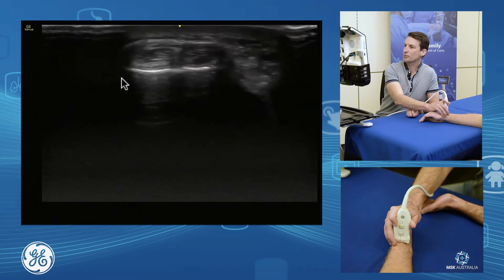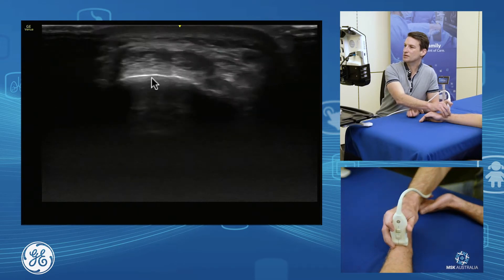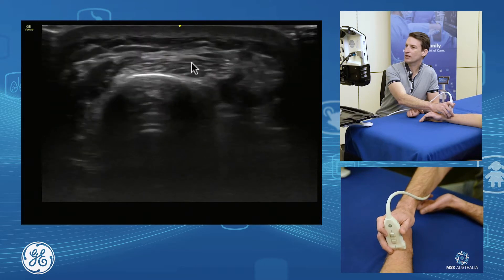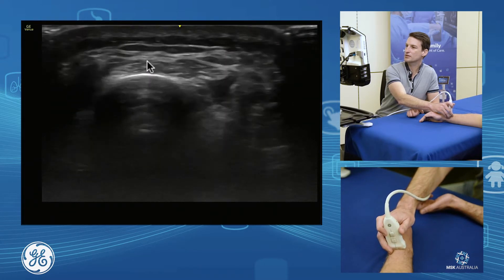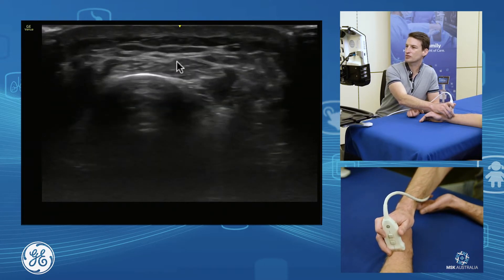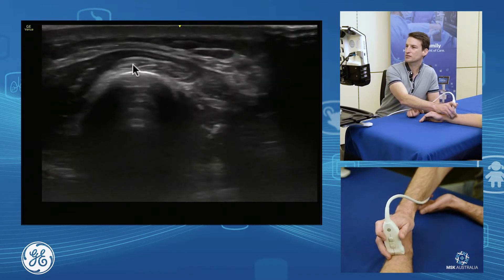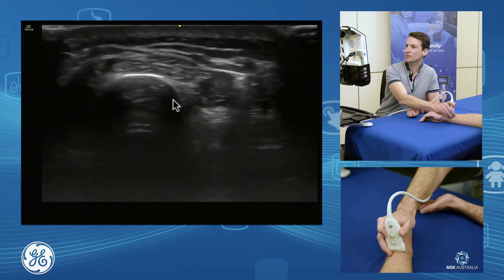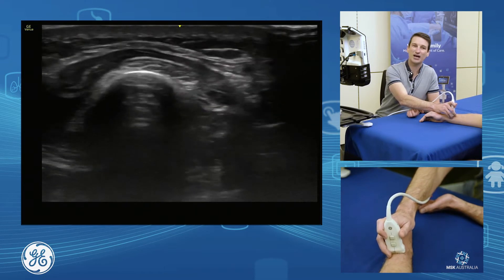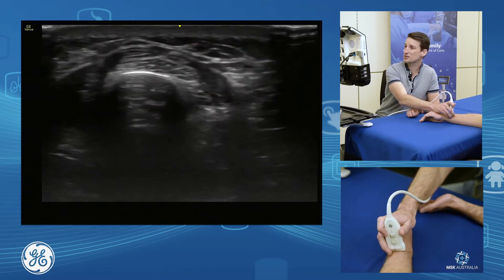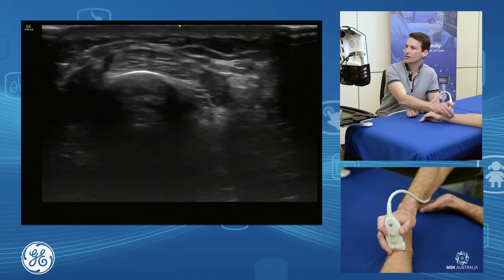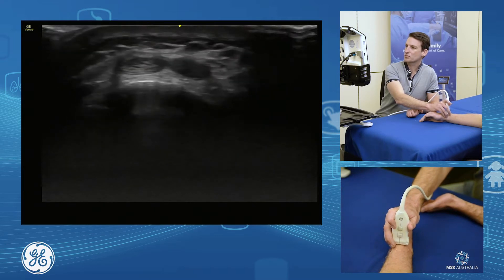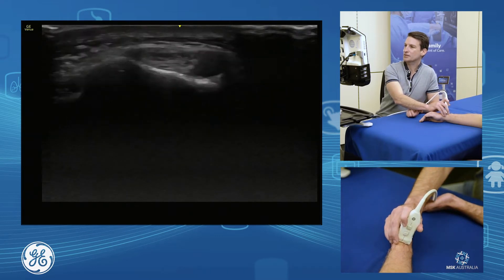If we follow our compartment two tendons up the wrist and up the forearm, we have our compartment one tendons crossing those. We can see those tendons crossing over the top — this is where we might get intersection syndrome in our rowers or racket sports athletes.